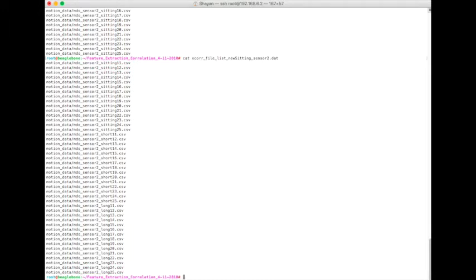Now, the use of the feature extraction correlation for us was to get the autocorrelation of the features. The feature produced is cross-correlation of the features and autocorrelation of the features, and you choose how to do it. That means that you choose which axes of the motion you want to perform cross-correlation and autocorrelation on. In order to do that, the C file has to be edited. Now, I will demonstrate the edits on the C file.